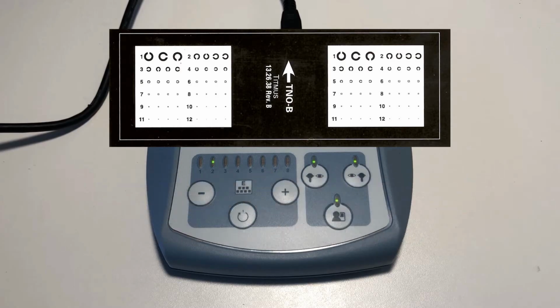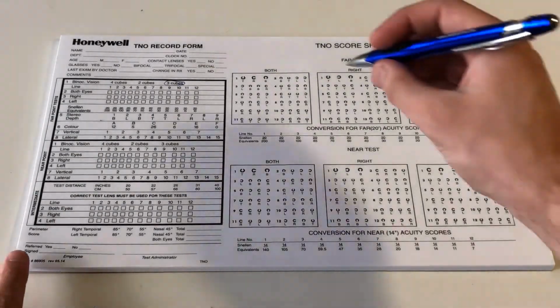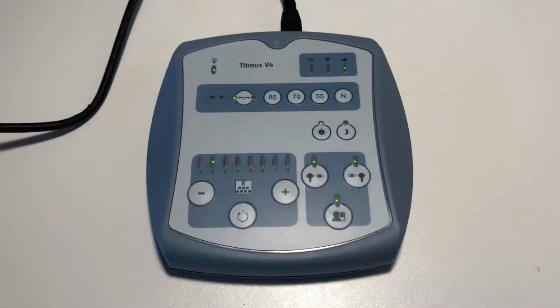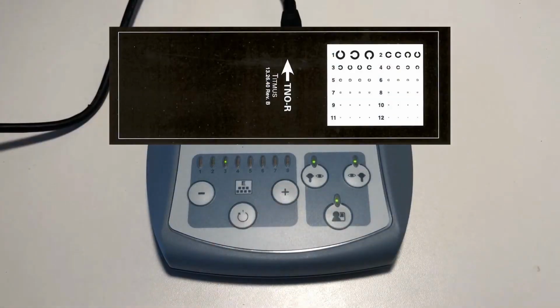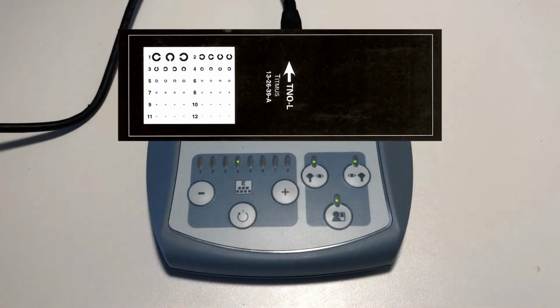If the patient gets 3 or more correct, ask them to read the next smallest line. If they get less than 3, have them read the next largest line. Mark the last line in which they were able to correctly read at least 3 C's on the record form. Slide number 3 and number 4 are similar, but test just the right eye and then just the left eye. The procedure is the same as for slide number 2.